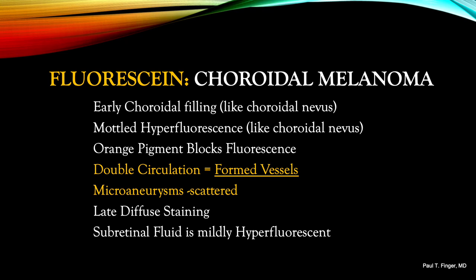Turning to fluorescein angiography of choroidal melanoma: it is a choroidal tumor, so we expect early choroidal filling. Like a choroidal nevus, we expect mottled hyperfluorescence of smaller tumors trapped beneath Bruch's membrane and the RPE. We see orange pigment, and pigment blocks fluorescence, so orange pigment will also block fluorescence. Once the tumor has broken through Bruch's membrane and the RPE, we're likely to see a double circulation. We can also see formed blood vessels within and on the tumor. Microaneurysms will be best seen on fluorescein, and are often present. Like most choroidal tumors, there will be late diffuse staining, and many characteristics will have passed in the early phases of the angiogram.